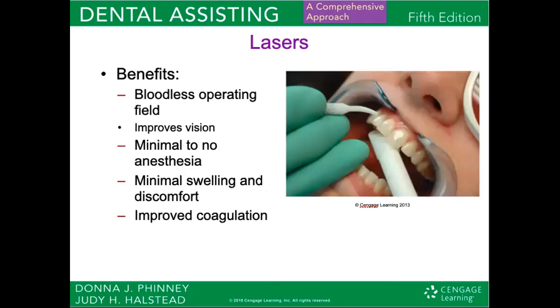The benefits of lasers is they provide a bloodless operating field. This is because as they are working, or if they're used to cut tissue, for example, the heat from the laser also cauterizes the tissue completely, so that the tissues don't bleed. This is really nice because it improves the vision to the operator, so that they are only making the most precise or the most necessary cuts. Another nice thing is that there is minimal to no anesthesia required. There is minimal swelling and discomfort to the patient, and improved coagulation. So if there is any gum bleeding afterwards, it usually stops or coagulates right away.